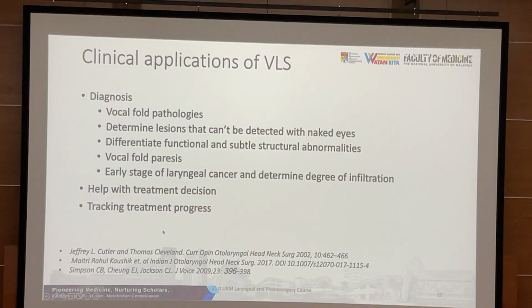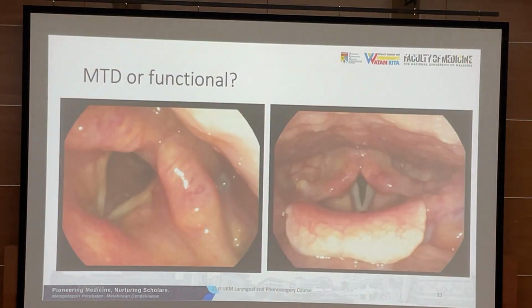So I mentioned vocal fold polyp. You don't need stroboscopy to diagnose a vocal polyp, but you need the stroboscopy to track the treatment progress. Before you remove the polyp, you show the patient, this is how you've been speaking, that's why your voice is hoarse. After surgery, you do it again and show the difference, and whether any vocal fold scar occurred as a complication of the surgery.